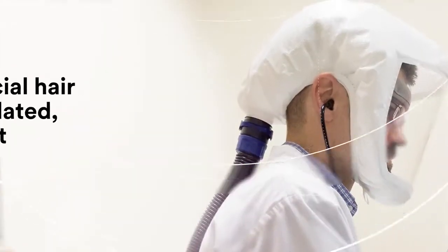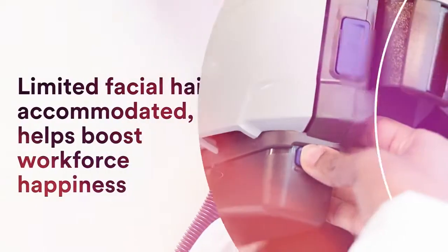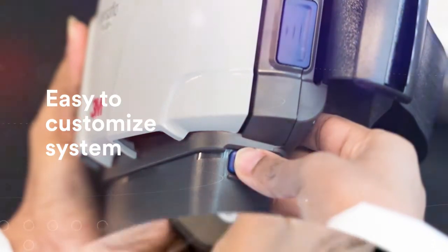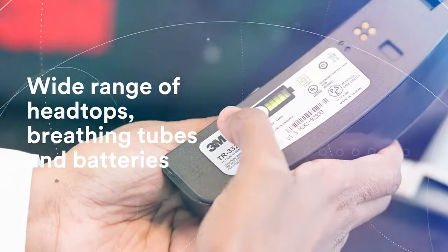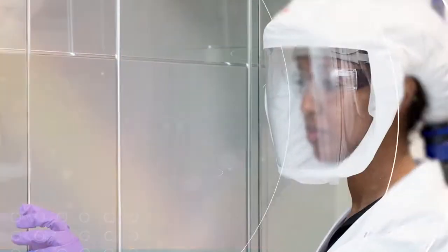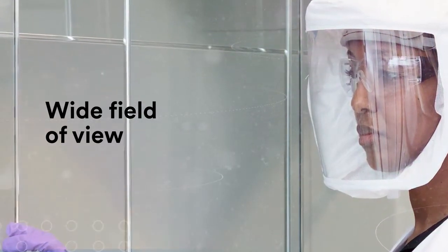Want to keep your facial hair? Loose-fitting head tops accommodate a limited amount of facial hair. The customizable system uses color-indicated connections and compatibility indicators for the wide range of head tops, breathing tubes, and batteries that are available. Most head top options have a wide field of view to help you connect to your patients and your work.